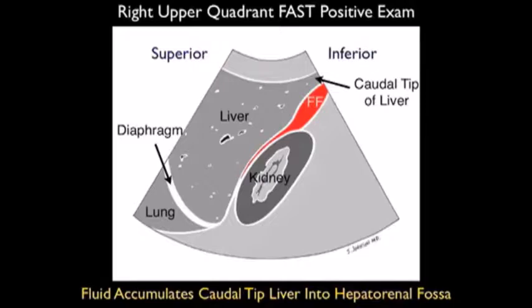This is very important to emphasize: many times fresh fluid can only be seen around that caudal tip of the liver, and then it will move into that hepatorenal interface or Morrison's pouch.